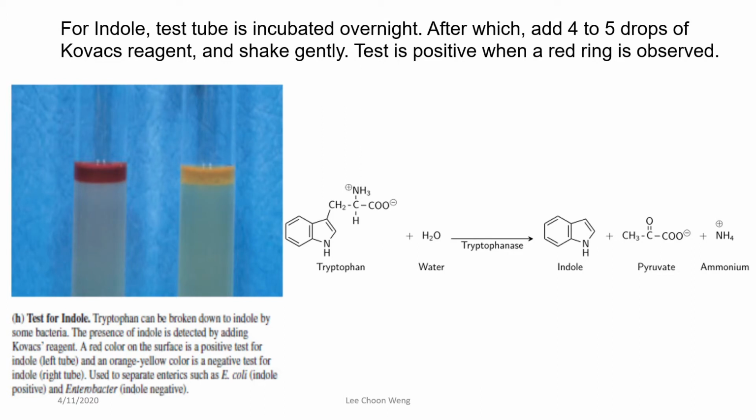The Indole Test is part of the IMViC test. IMViC stands for Indole, Methyl Red, Voges-Proskauer, and the Citrate Utilization Test. So IMViC represents four different kinds of tests that are very useful in the identification of gram-negative bacteria.